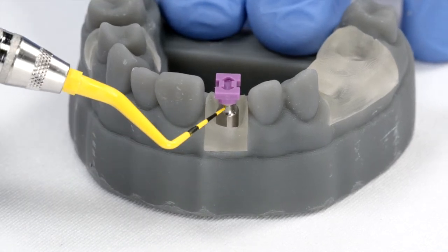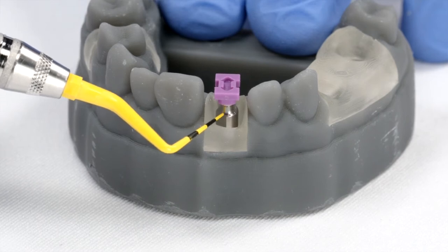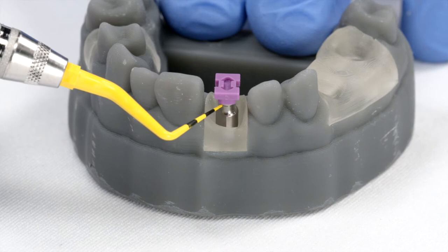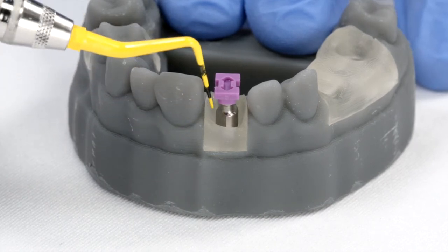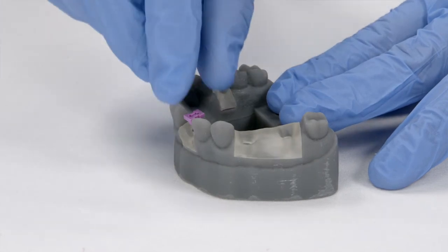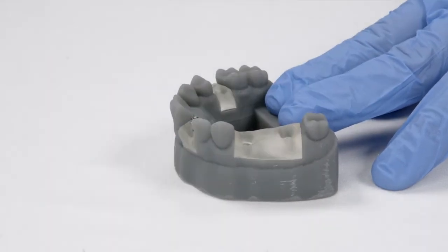But looking from the front, notice a little portion of the impression post is exposed. This is going to be more difficult to take the impression by itself because the implant is very deep inside of the soft tissue. It's best to take this out and replace it with a long impression coping.